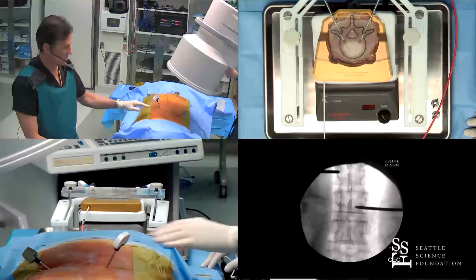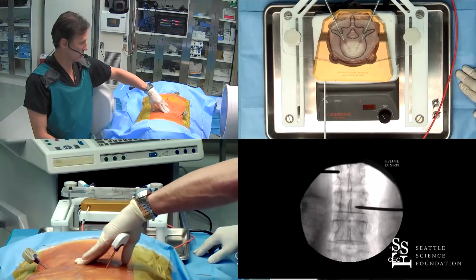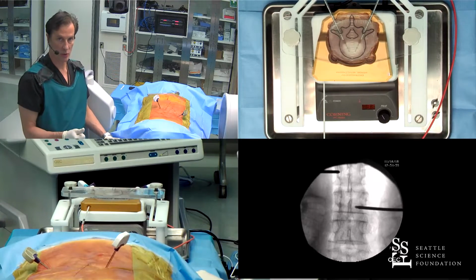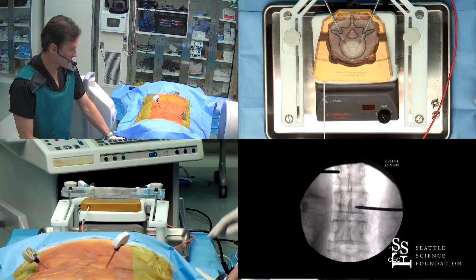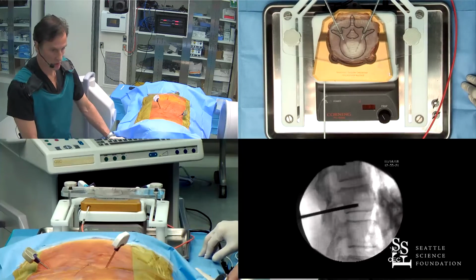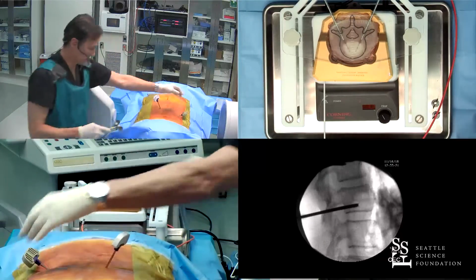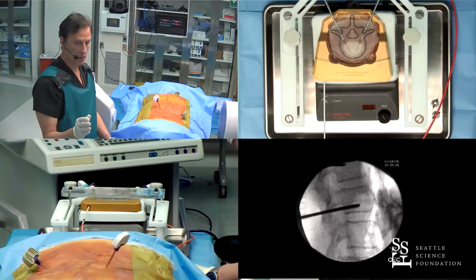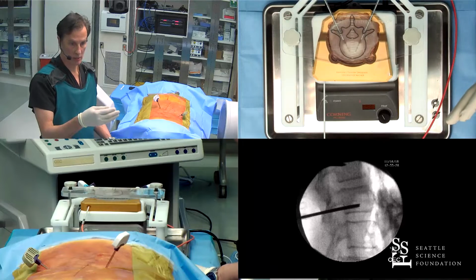The advantage of the extrapedicular approach. I was talking to Dr. Brian Rich, who said he's going to use this because this is an advantage for patients with hardware. There's a common belief that sometimes you can get around hardware, and this is just short of midline, so we're almost dead midline. We'll put the finishing touches on it, make it perfect. So it should be in the midline on AP, which almost certainly it is, mid to anterior portion of the vertebral body in the lateral view.